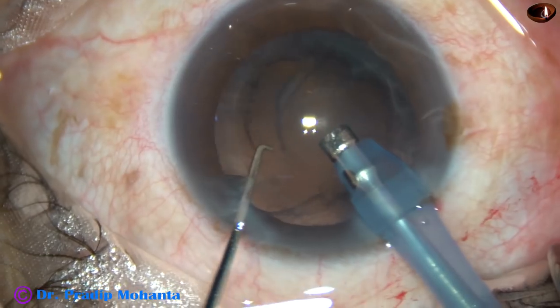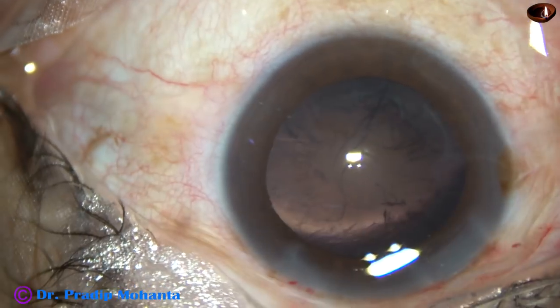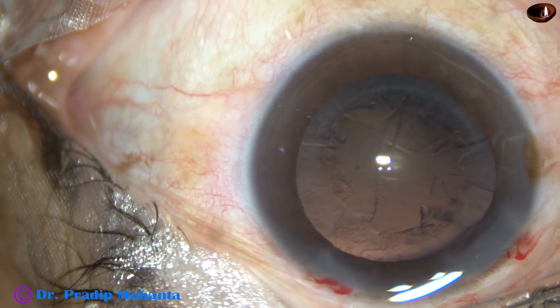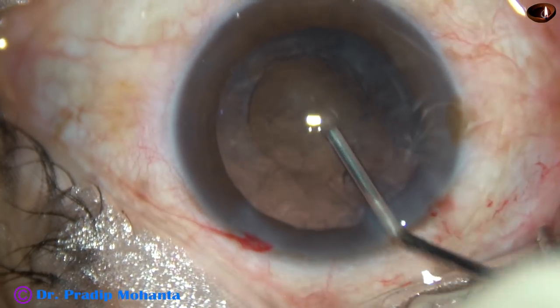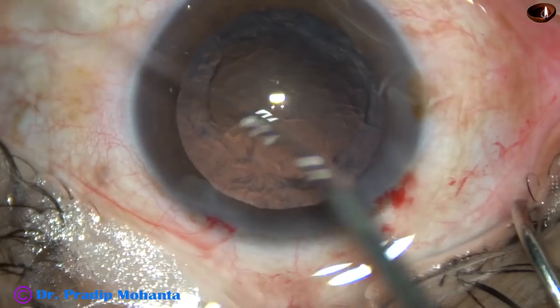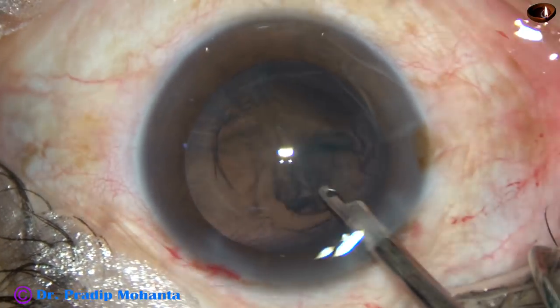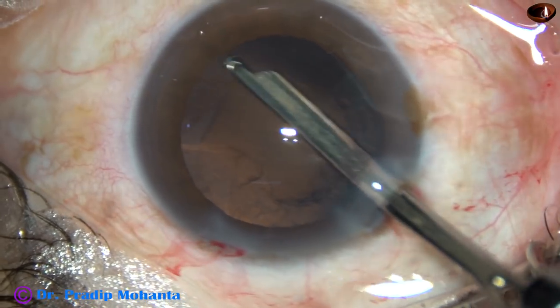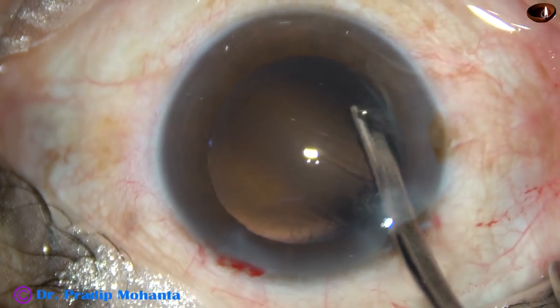So if the nucleus sclerosis is just grade one or one plus or two, you can attempt this technique. Beyond this — that is, if the nucleus is having a sclerosis of grade two plus or three — this technique is not necessary. You can hold the nucleus with vacuum and divide the nucleus using vacuum and the chopper.